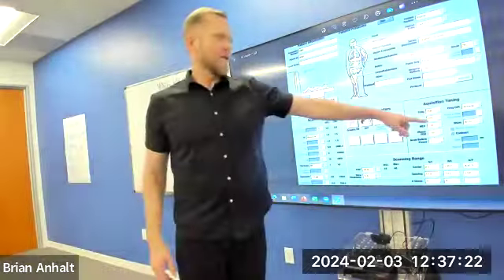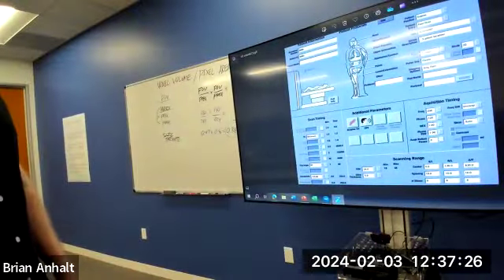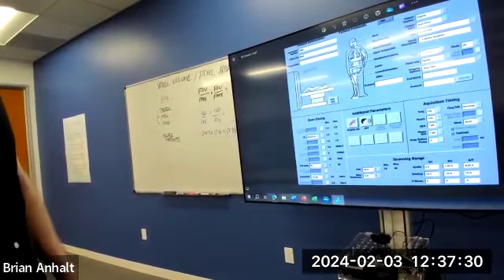So why do we have one matrix that's smaller than the other? That is because your phase matrix is directly proportional to your scan time.